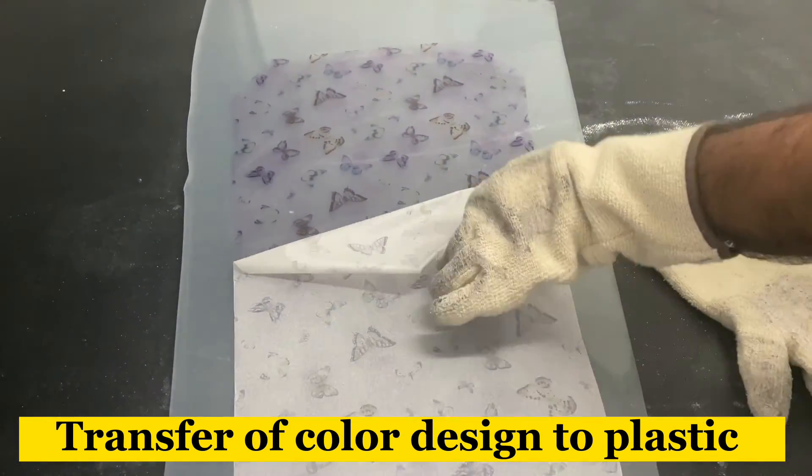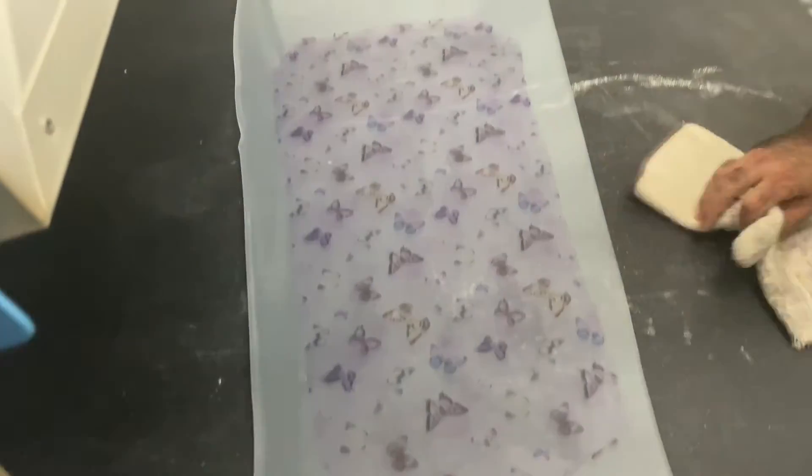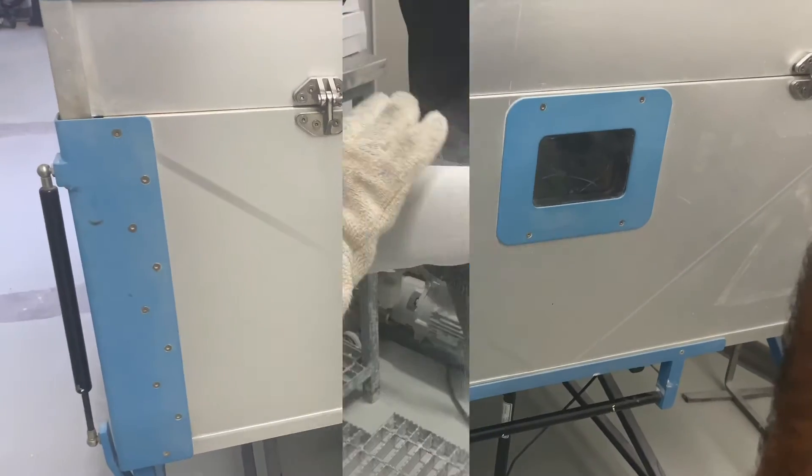Once you have done this process, you need to place the sheet back in the oven for at least one minute. This will give you extra shining and good color.